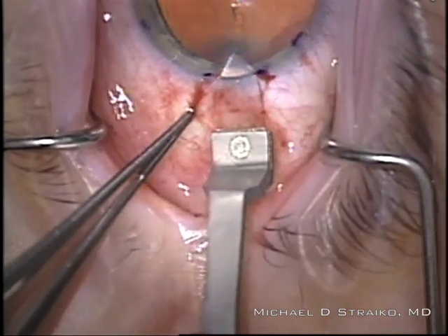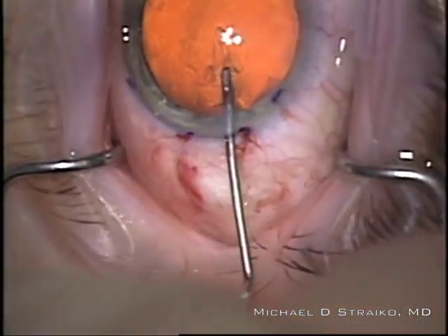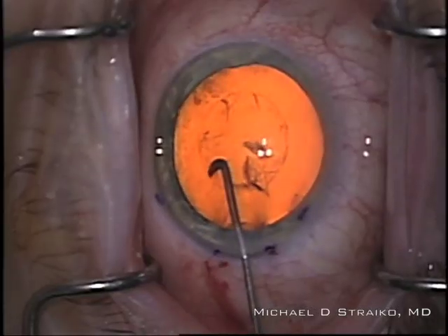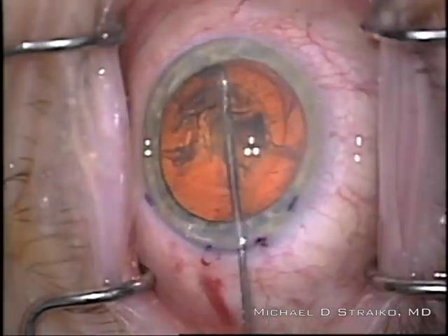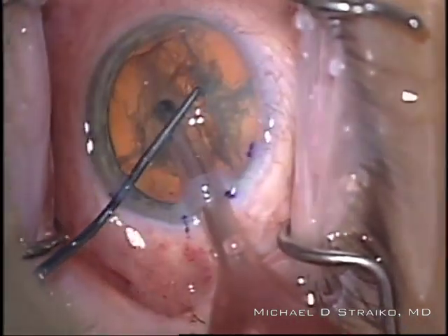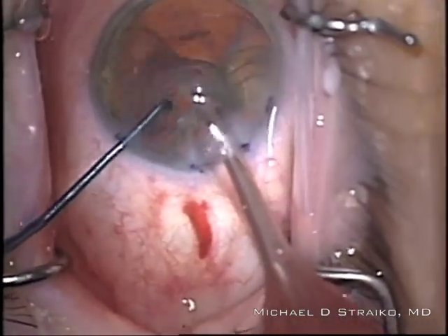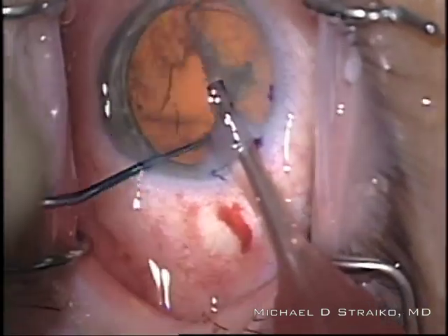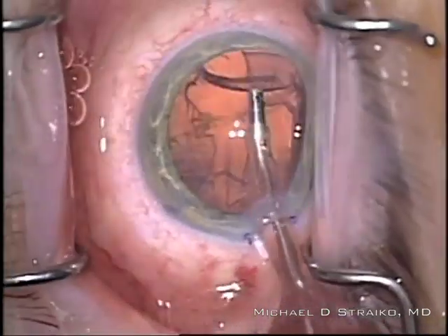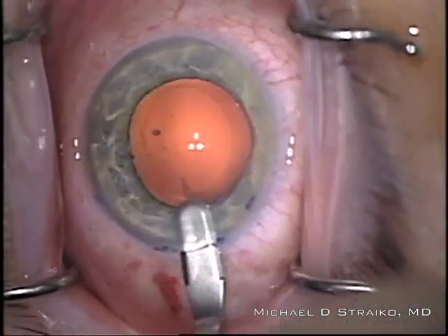I'm using a 2.4 millimeter diamond keratome to make my main incision for the cataract surgery, which I'll enlarge slightly later. I think it's important to keep the capsular rexis fairly small so that the intraocular lens is stable. This part is sped up — it's just my standard cataract surgery using a chopping technique. We clean up the lens and remove all of the cortical material. With that nice small rexis, we should have a very stable lens-iris diaphragm.